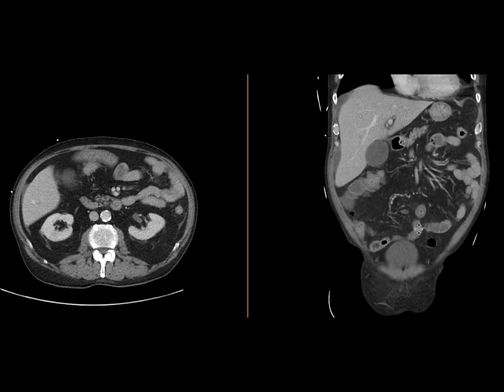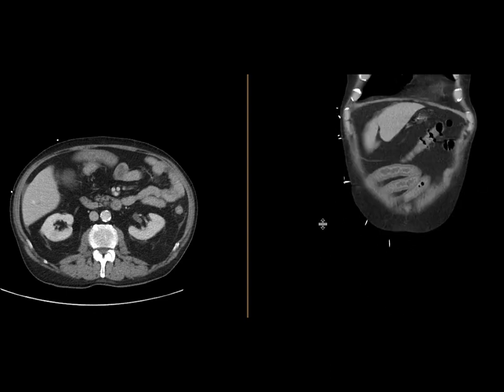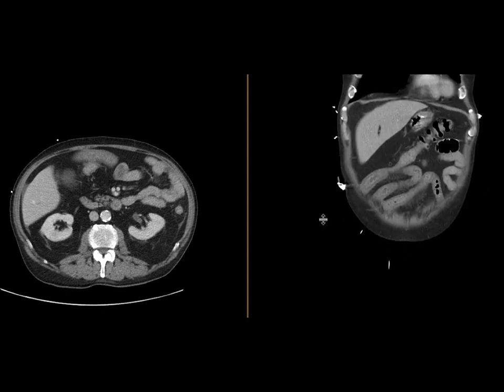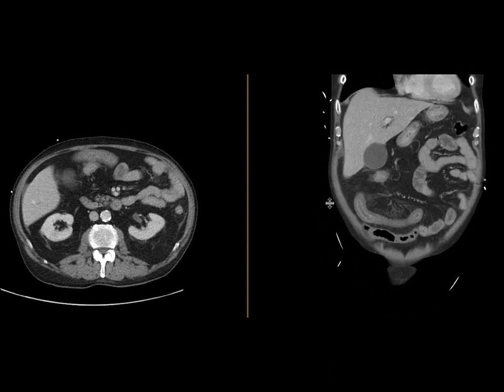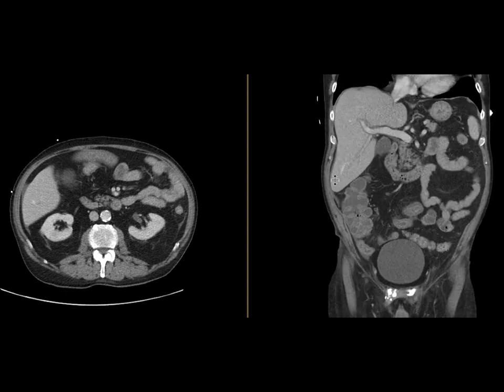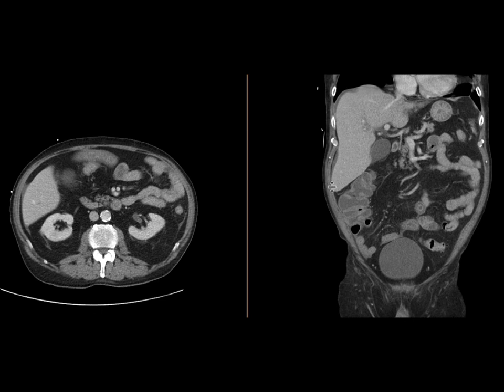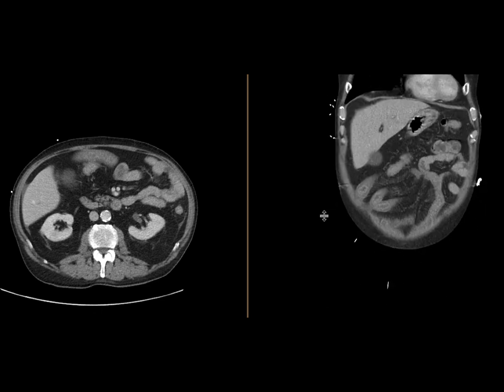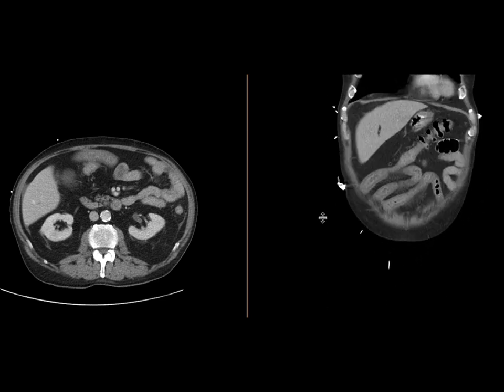Looking at this coronal image, there is a beautiful target sign here. So really, diffuse small bowel wall thickening and edema with some inflammatory change. The findings are in and of themselves compatible with an enteritis.